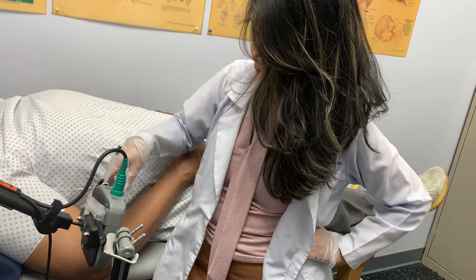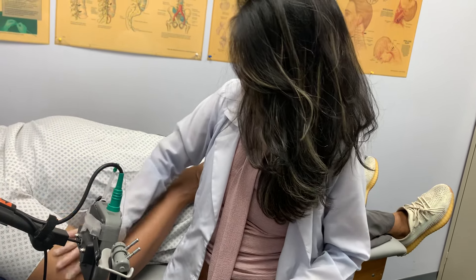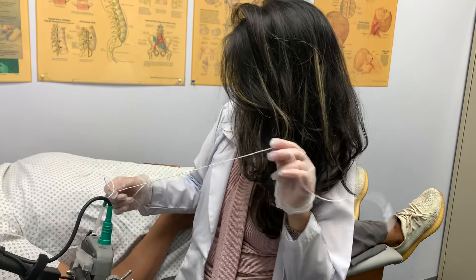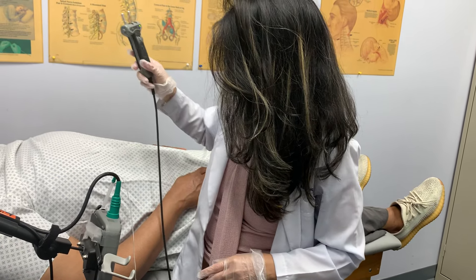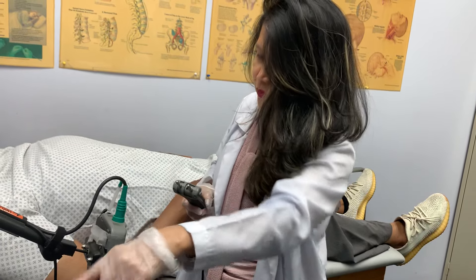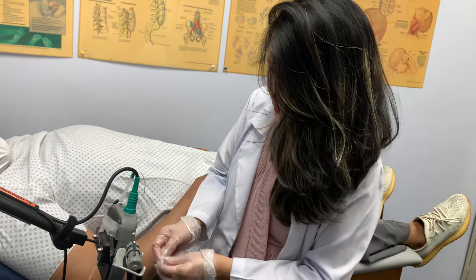There are two parts to this procedure. First, we'll check the muscles in the neck using a very small, very fine needle. Second, I will check the nerves using an electrical stimulator. Your muscles will jump, and then I'll see numbers and waveforms on the computer that will tell us how things are doing.